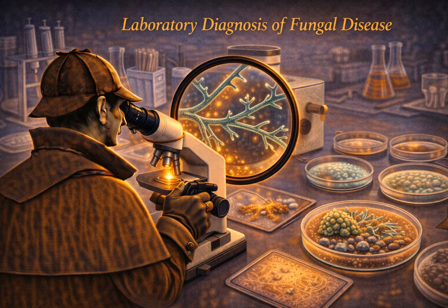That sounds completely logical. Why is that a problem for Rhizopus? It's a problem because of the unique structural anatomy of the mucormycetes. We have to visualize the microscopic structure here. Most molds, like Aspergillus, have hyphae. Those are the long filaments that have cross walls called septa. These cross walls add structural support, kind of like the bulkheads in a submarine. Okay, so they are compartmentalized.